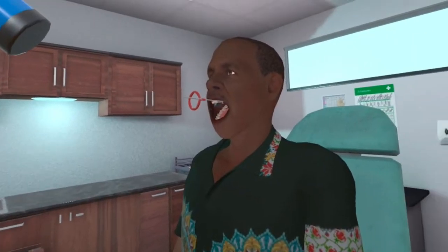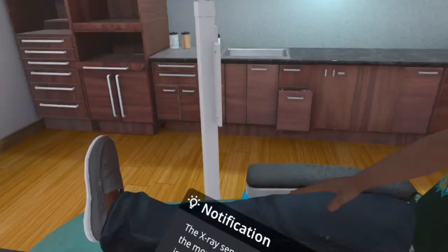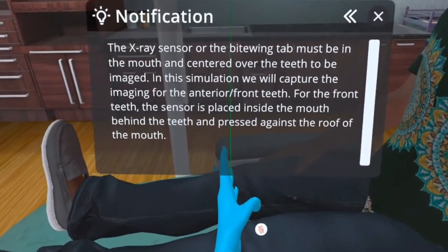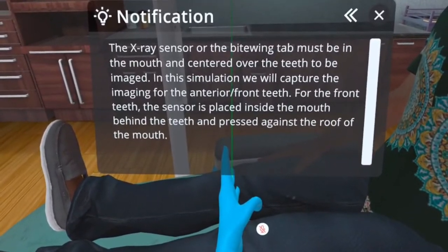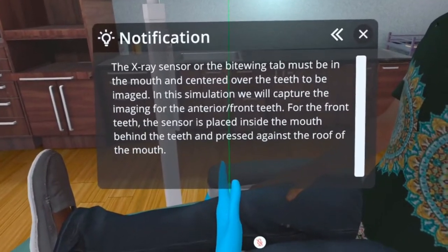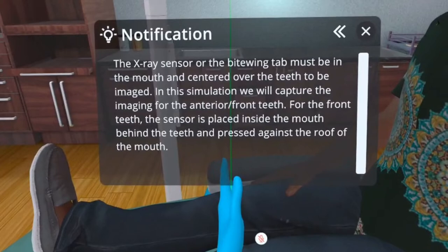The X-ray sensor or the bite wing tab must be in the mouth and centered over the teeth to be imaged. In this simulation, we will capture the imaging for the anterior, front teeth. For the front teeth, the sensor is placed inside the mouth behind the teeth and pressed against the roof of the mouth.